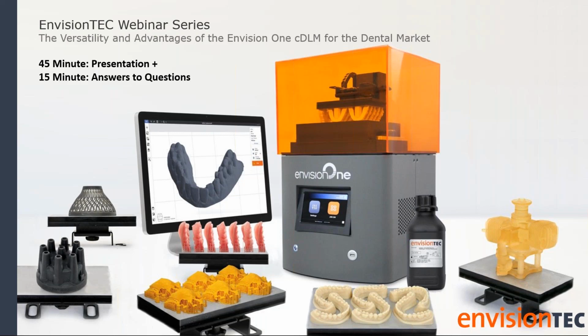After about 300 prints, as with any material tray in any continuous printer, after so many prints the film starts to become a little more hazy. It starts to lose permeability. It still works fine. You could probably go 350, even 400 prints with the material tray. We say 300 prints because we want to maintain a high level of accuracy and quality from your models.